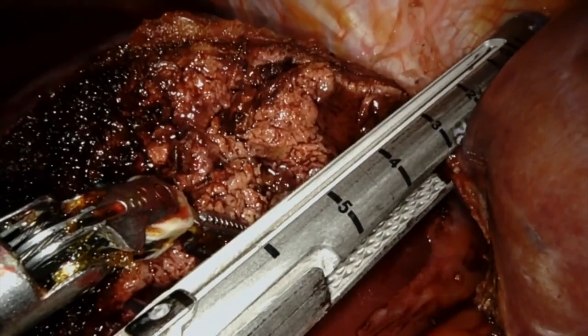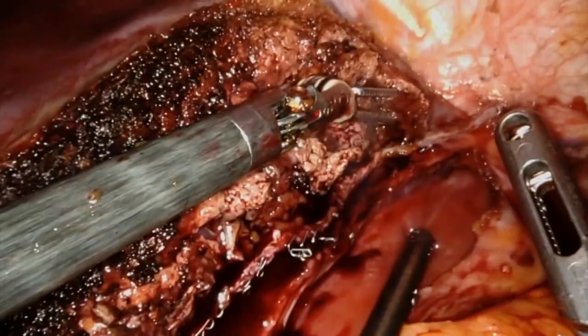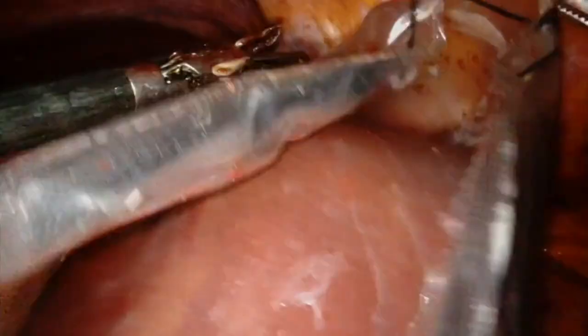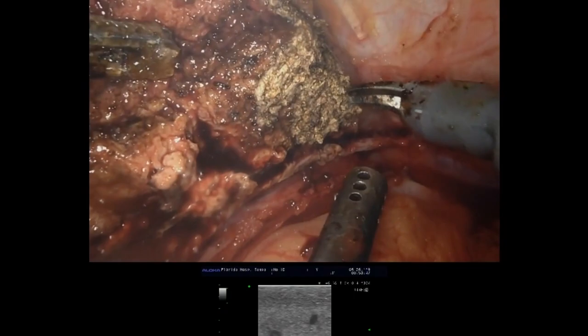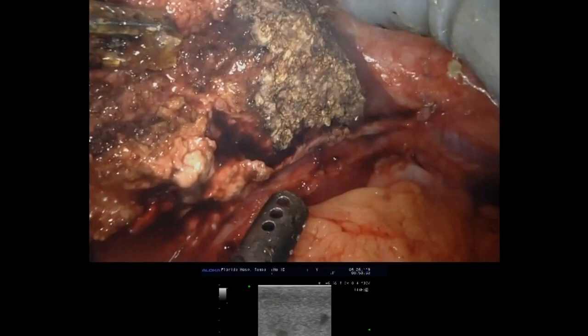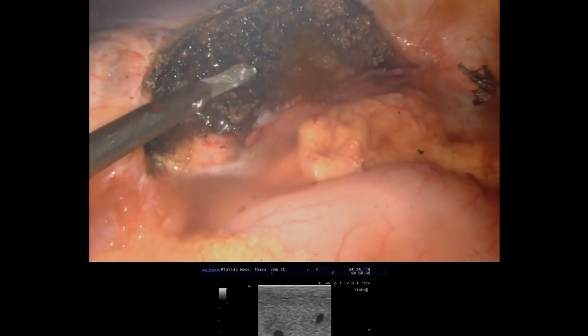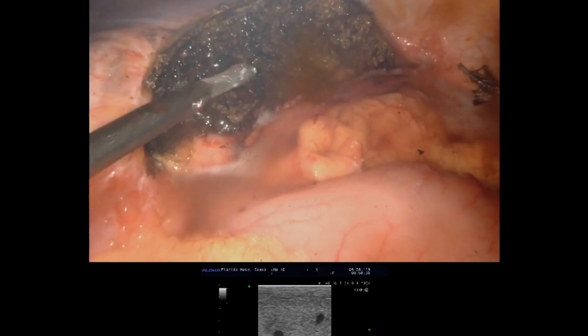Superficial liver parenchymal hemostasis was obtained with application of the bipolar robotic instrument. A large endoscopic retrieval bag was inserted into the abdomen to remove the specimen. The liver resection surface was dry without any evidence of bleeding or bile leak. Marcaine injection was given into the abdomen to minimize post-operative pain, and the port sites were closed under direct laparoscopic visualization in a standard manner.